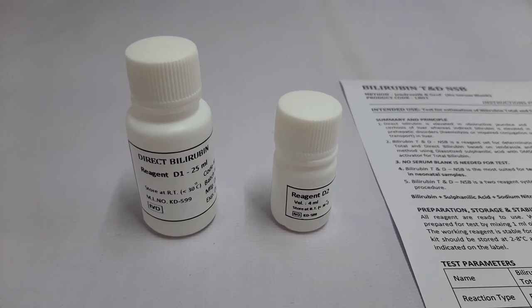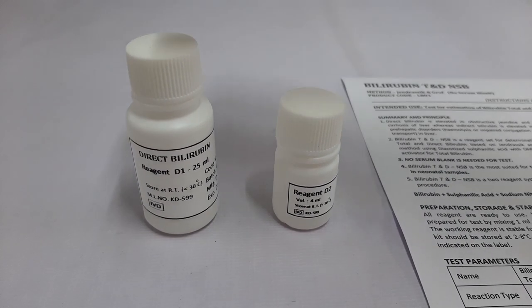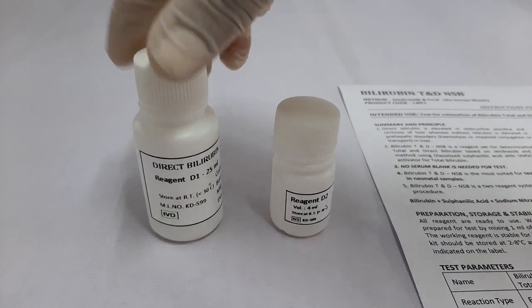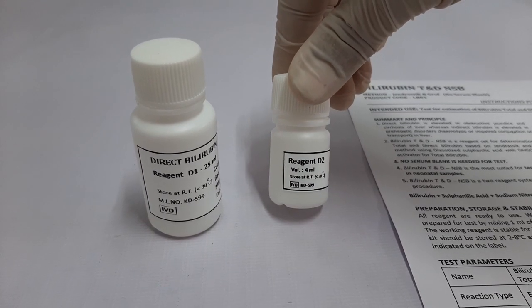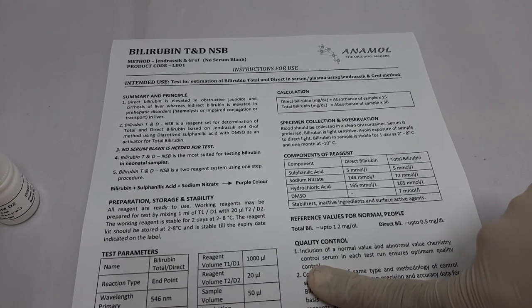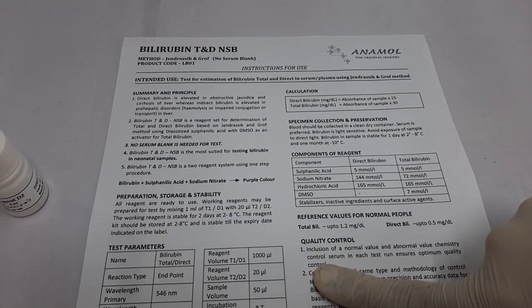First, let's have a look at the kit components. The kit contains bilirubin direct reagent 1 or D1, bilirubin direct reagent 2 or D2, and the instructions for use. We recommend all users to read the instructions for use thoroughly before using the test.